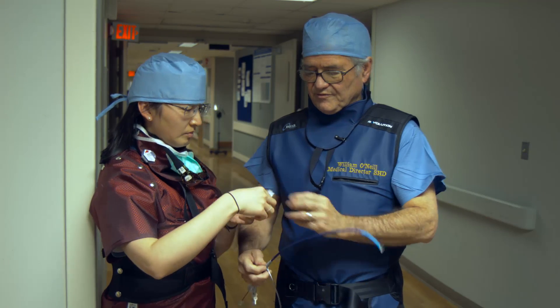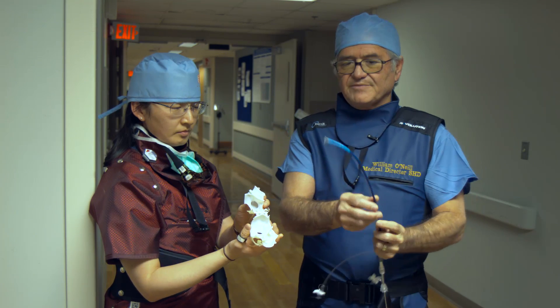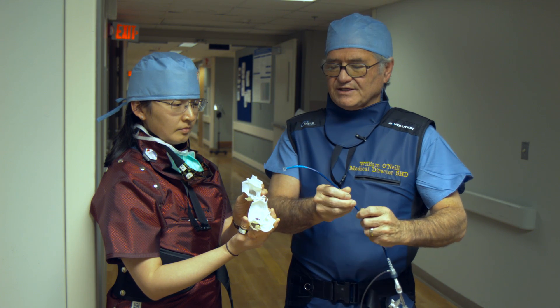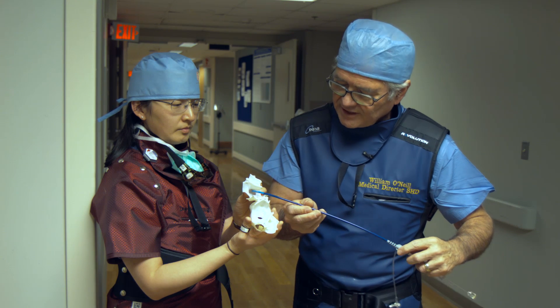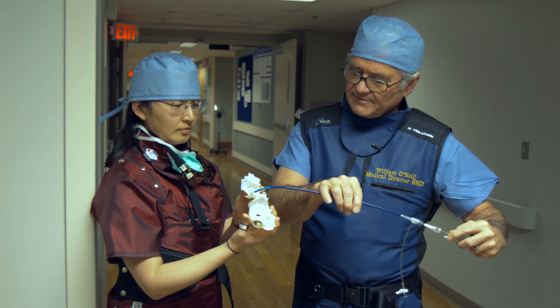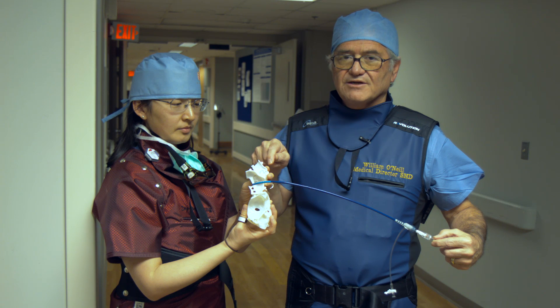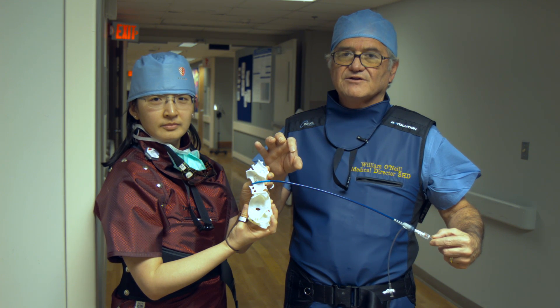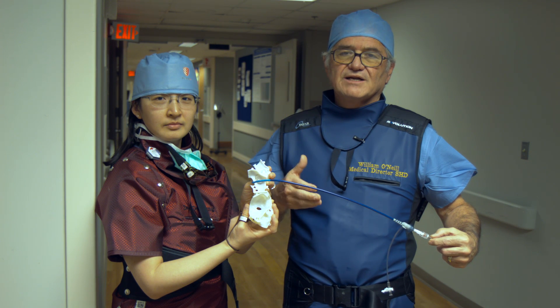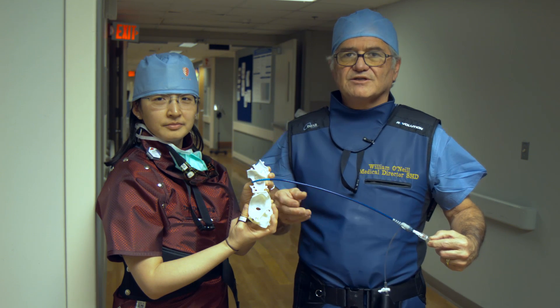If you would just hold this open so we can look at the camera. This is basically the sheath that goes in — it's going to go into the left atrial appendage and then we're going to deploy the device. This goes through the intra-atrial septum and then when the device is properly positioned we will place it. You can see that it's actually sitting quite nicely in this appendage. We know that this particular device will sit and completely occlude this left atrial appendage, and we can do this all ahead of time before the patient's ever on the table. This has dramatically improved our success rate in placement of this device and also improved the safety.